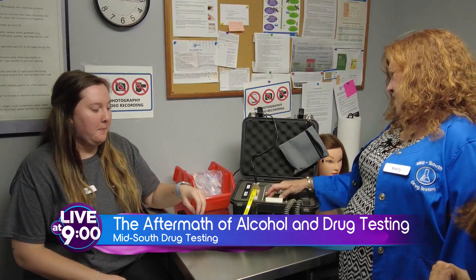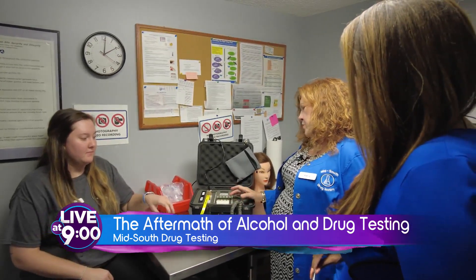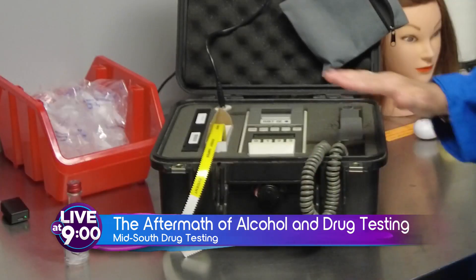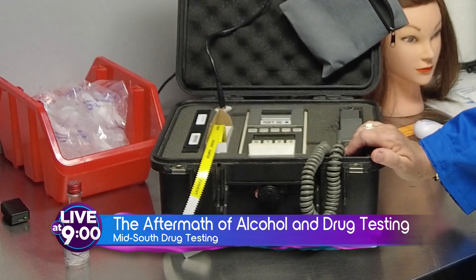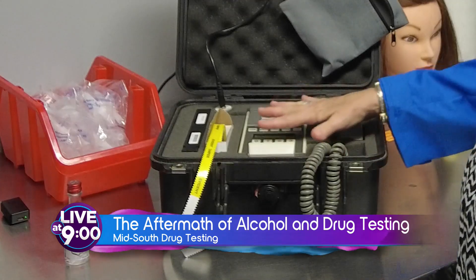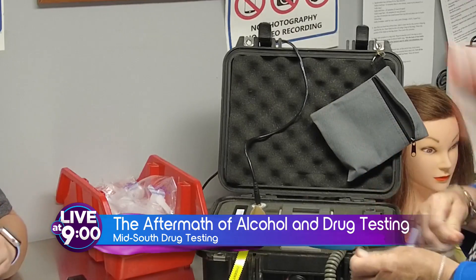I am. It asks a few questions — it wants to know what your ID number is, it wants to make sure the date and the time are correct. It's looking for alcohol in the breath, which equates to alcohol in the blood. There's an equation that it goes through, and all the components inside know what that is. Then it wants you to insert a mouthpiece.